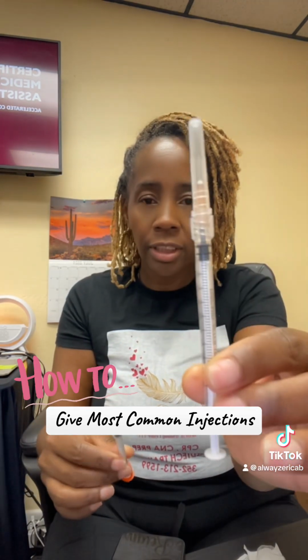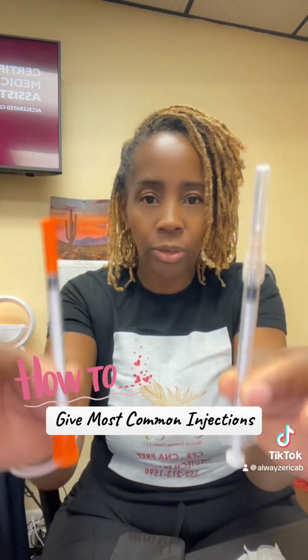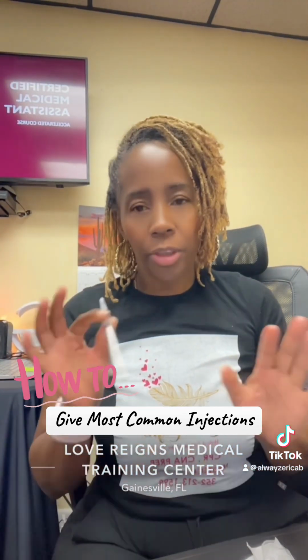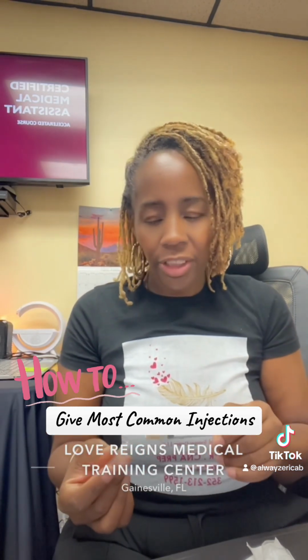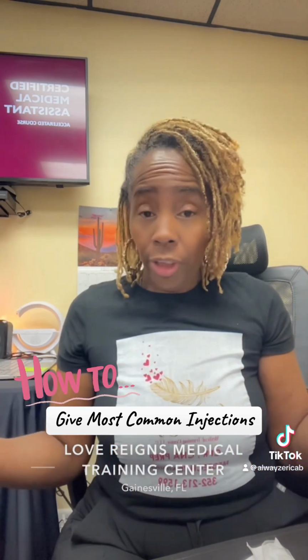And that injection, this needle and this needle, are technically subcutaneous. They are both considered subcutaneous because you technically could give a subcutaneous injection with this needle, but they are used differently, okay? Most people use the brown top needle for PPDs, to check and make sure you are free of tuberculosis.